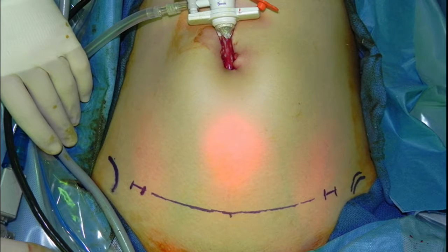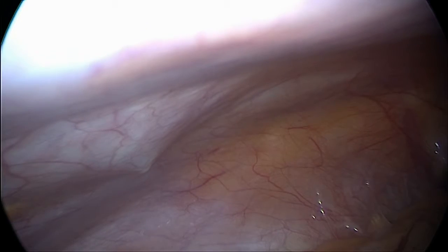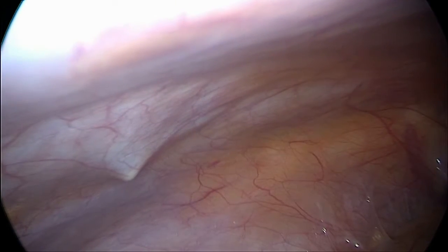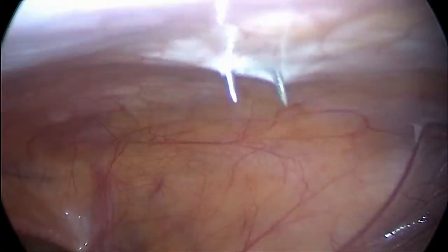Here, initial Veress needle placement is shown with the anterior superior iliac spines marked. Umbilical camera port placement is then performed. The 8mm robotic working ports are then placed at the lateral aspect of the line of Pfannenstiel, superomedial to the ASIS. The ports are tunneled at an angle as they are passed through the abdominal fascial layers, allowing the trocars to then be rotated superiorly into the final working position.